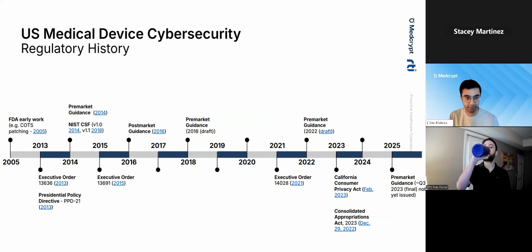The FDA, for example, has evolved more and more quickly in recognizing the need for cybersecurity in medical devices. And in addition to the pre-market and post-market guidances that have come out and the updates over the past decade, there's also been other regulatory changes from things like executive orders from the White House, as well as laws being passed to actually give the FDA the authority to enforce cybersecurity.